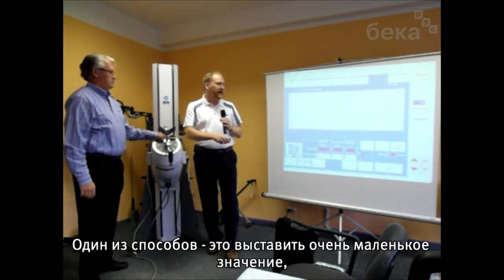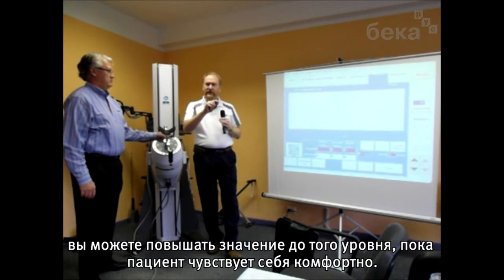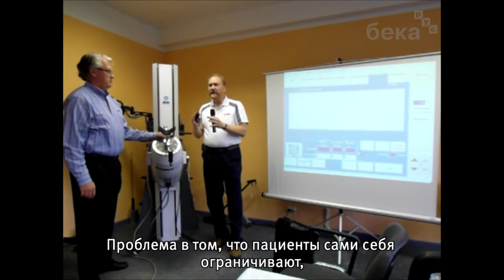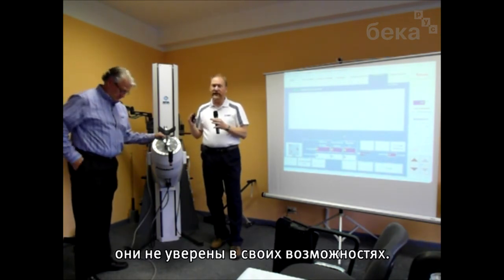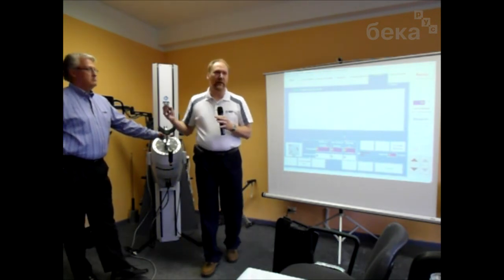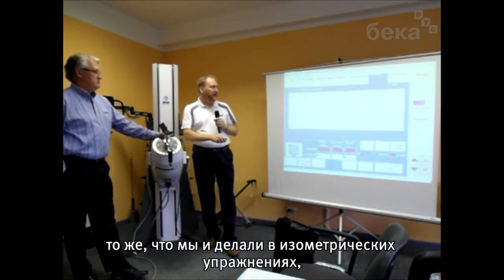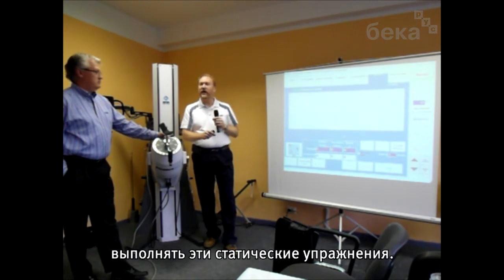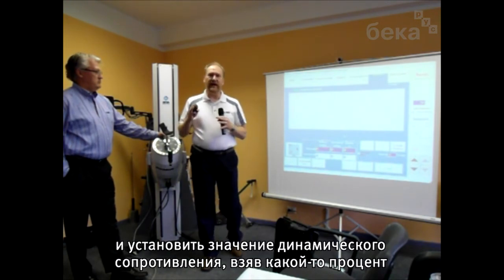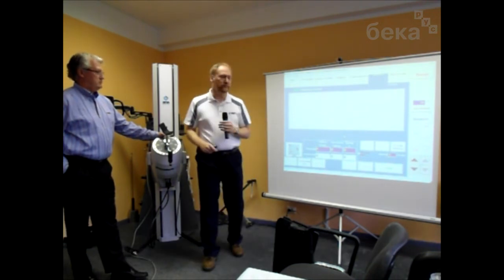One of those is to set it at a very low level and have the person start exercising. While they're exercising, you can make increases until it gets to a level that they tell you is comfortable for them. The problem with that is that they could be self-limiting, they could not be sure what they can actually do, so they'll tell you that it's comfortable when they could actually tolerate more and get a better result. So a more objective way of setting the resistance is similar to what we did in isometric exercise, is to do that static trial, take a measurement of what his maximum force is, and then set the dynamic resistance at a percentage of his maximum strength.